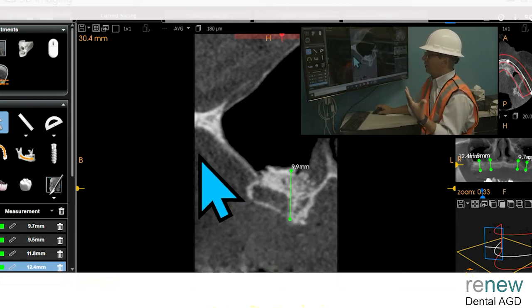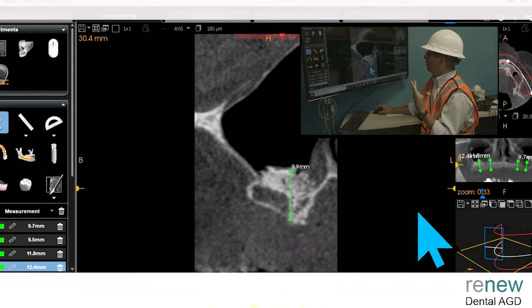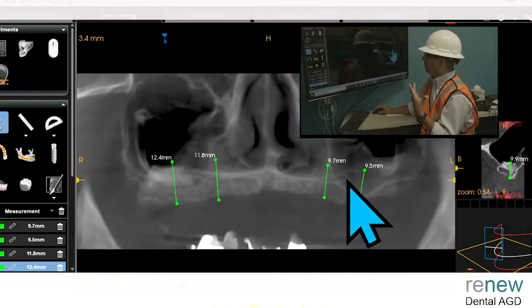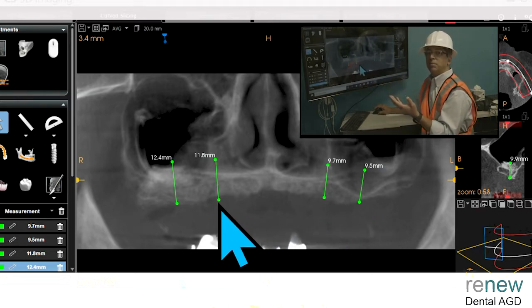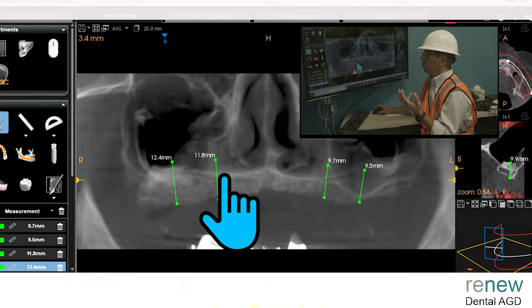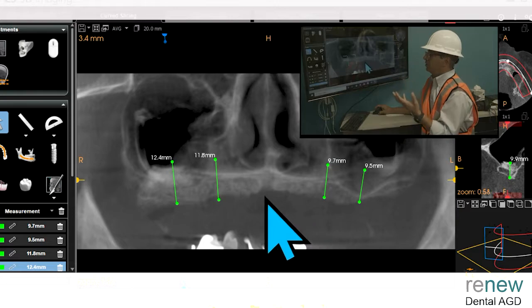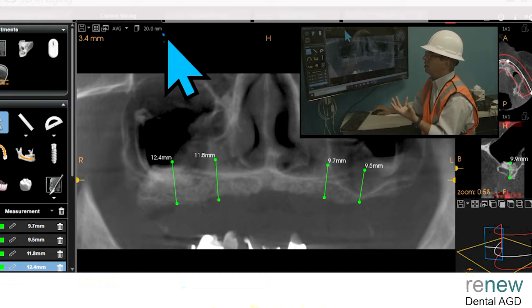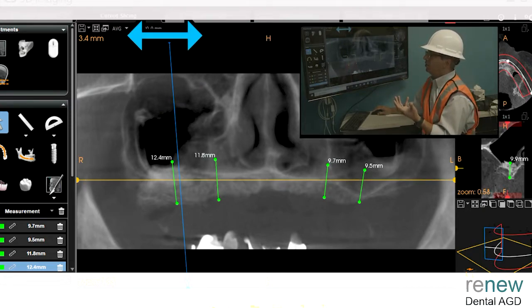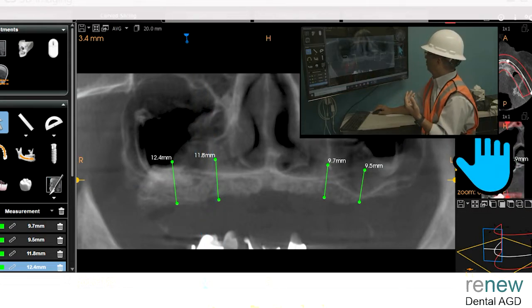The other hard part is you have a lot of detached gingiva here. So your restoration, if you're going to go on this kind of layout, you might be doing a locator here, or you do an overbar, but I certainly would never recommend doing a fixed hybrid case here. It's just too weak, and we haven't even looked at these, but these are all going to be weak. You don't want to do that. So unfortunately, if you're trying to do something for this case, or you've already started a case like this and you're trying to salvage it, you're going to have to go with the lateral sinus lift and try to bring it forward.